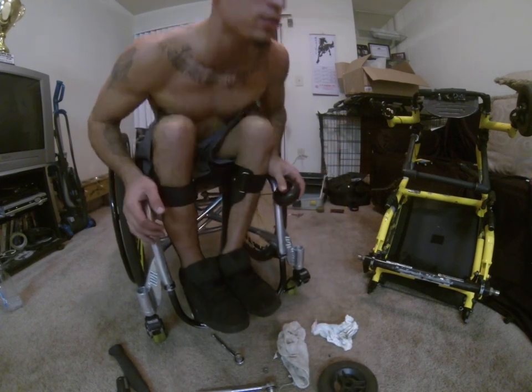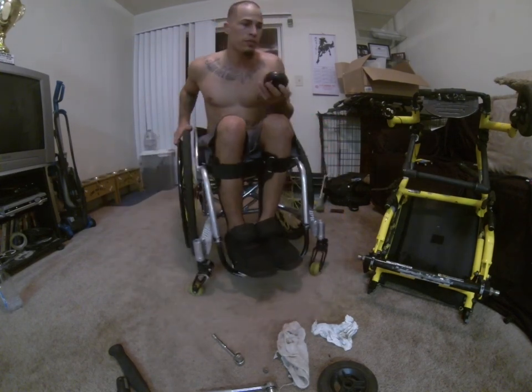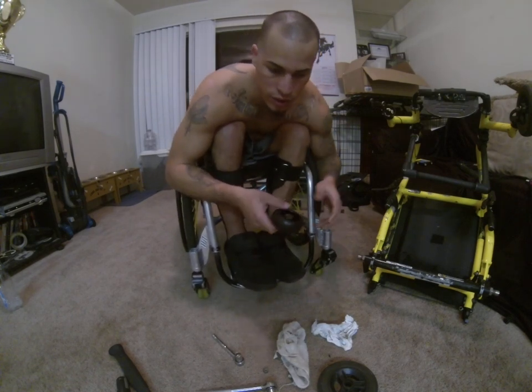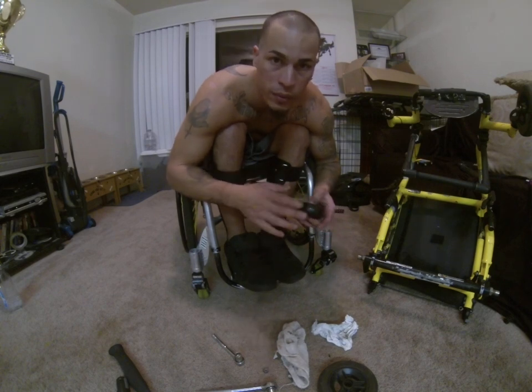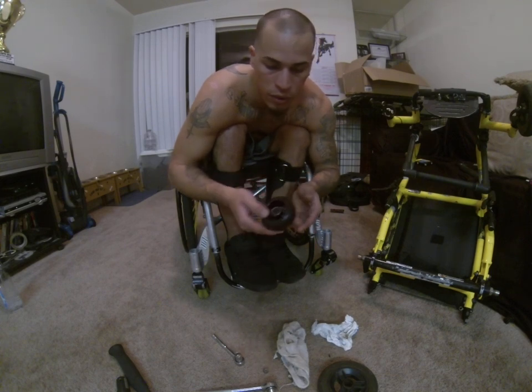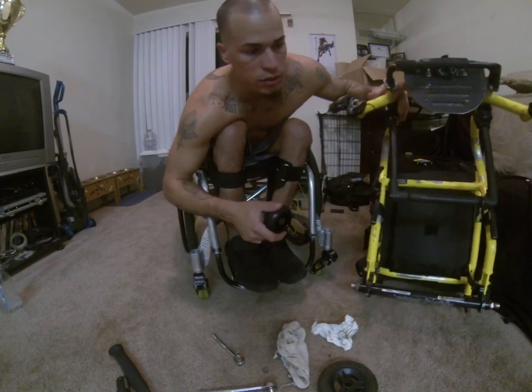You can go on websites and search for, you know, wheelchair websites and stuff like that to find different wheels. If not, you can go to like a skate shop or Play It Again Sports or something like that, and you can find scooter wheels or rollerblade wheels. It'll fit right on there. It'll be the same exact size for the bearing. These are like ABEC 5s or the Reds bearings. Should fit right on there. Pop them in, and you're good to go.